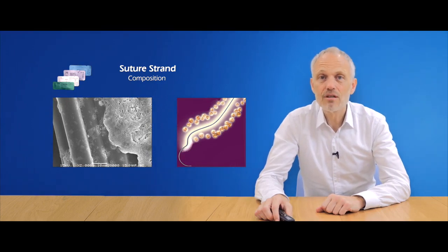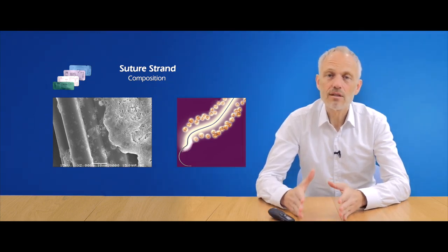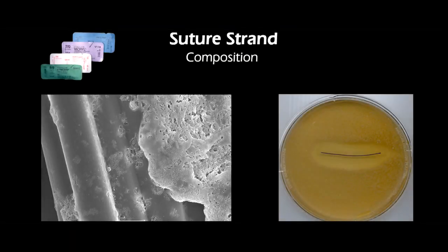That's why I prefer the sutures to be removed at the earliest time point possible. I think there is no one general time point ideal to remove the sutures. It depends on the surgery and on the stability of the wound when we remove the sutures. On the right side you see such an inhibition zone by triclosan on this suture strand. Today we not only have the resorbable ones that are coated with these inhibition solutions, but also the non-resorbable ones.